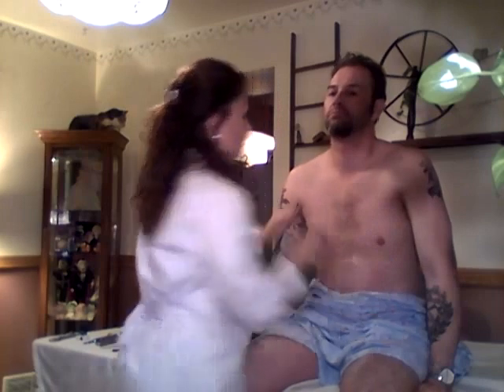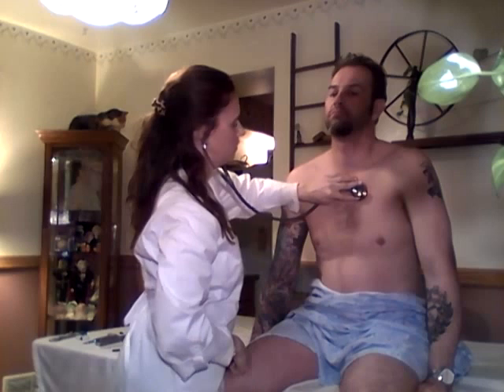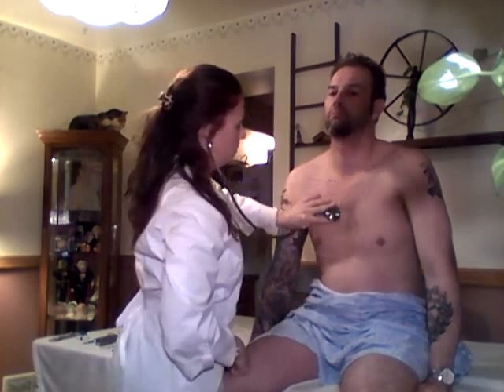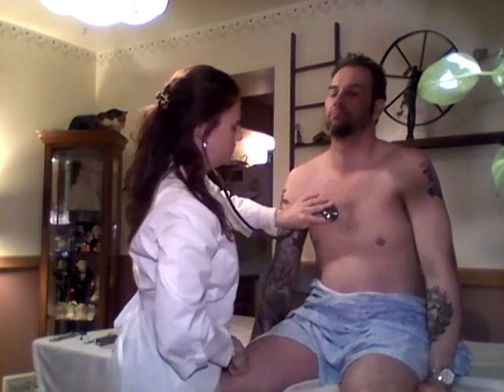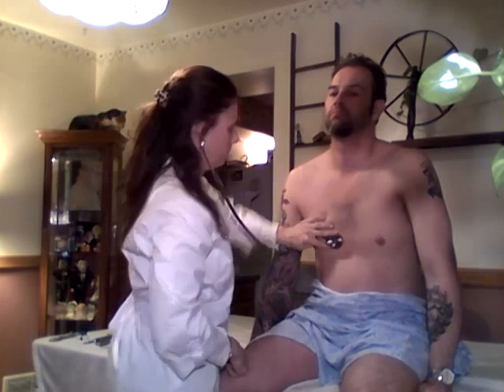Okay. I'm going to listen for the heart, starting at the aortic, pulmonic, Erb's point, tricuspid, and mitral.